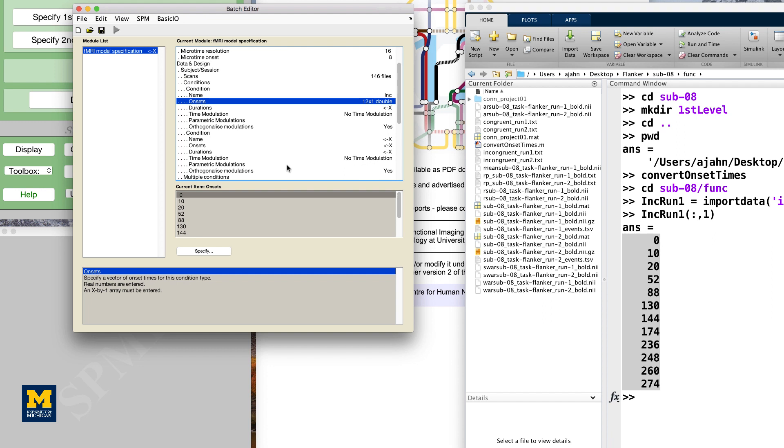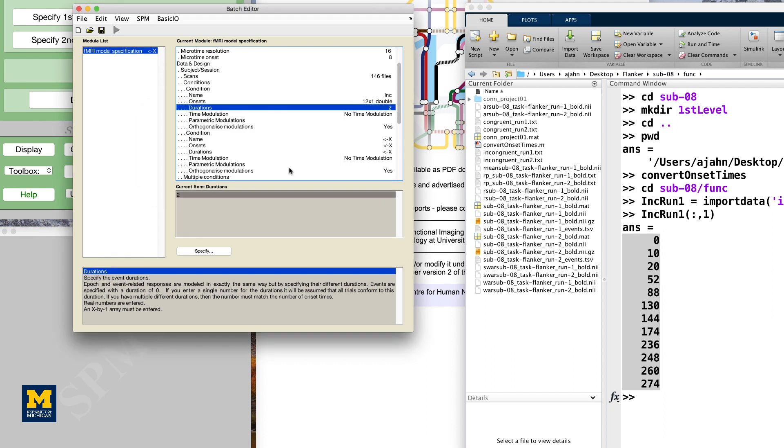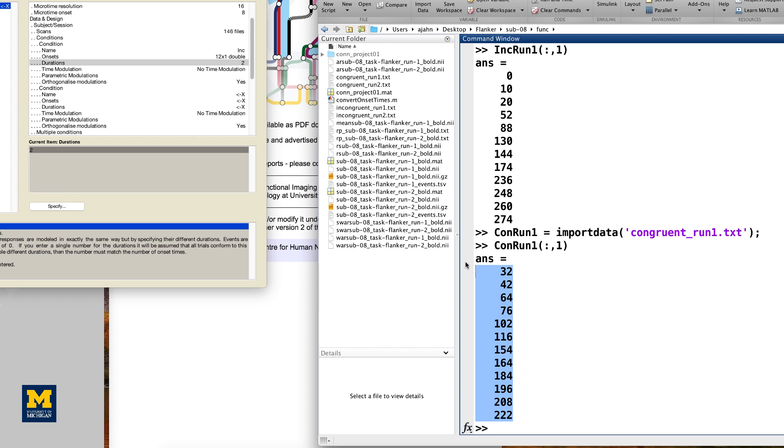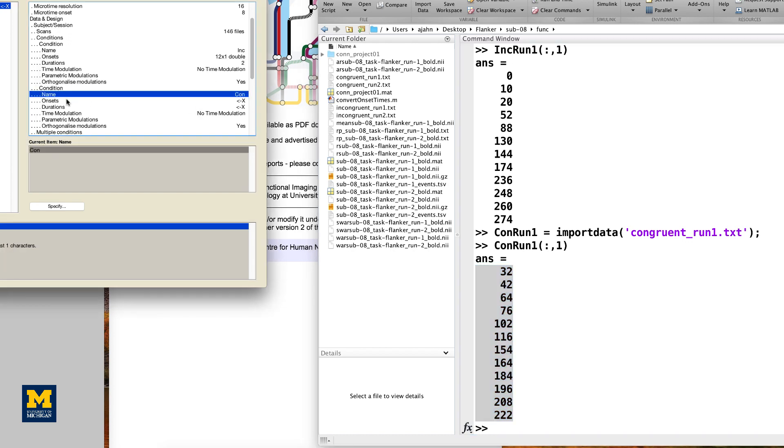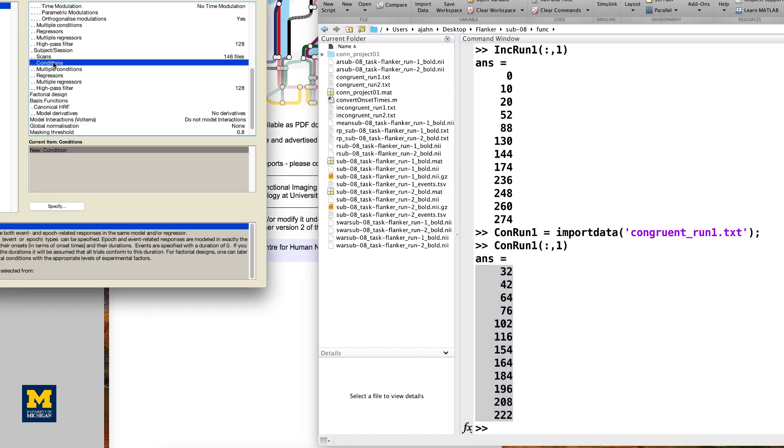In this experiment, each trial lasted for 2 seconds. If we enter the number 2 in the durations field, SPM will assume that it is the same duration for every trial. Now do the same procedure for the congruent condition for run1 and the incongruent and congruent conditions for run2, remembering to enter a duration value of 2 for all of the different conditions.